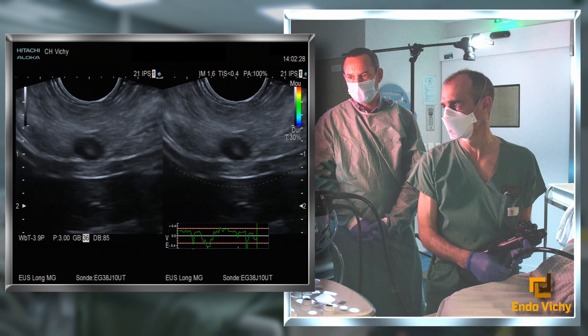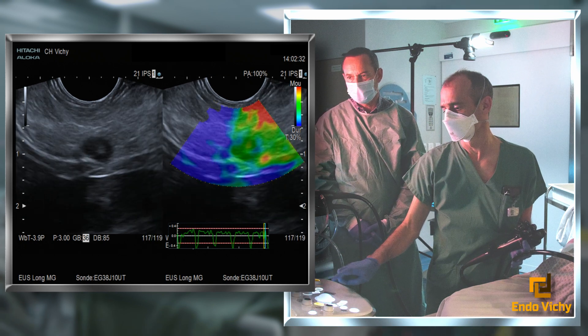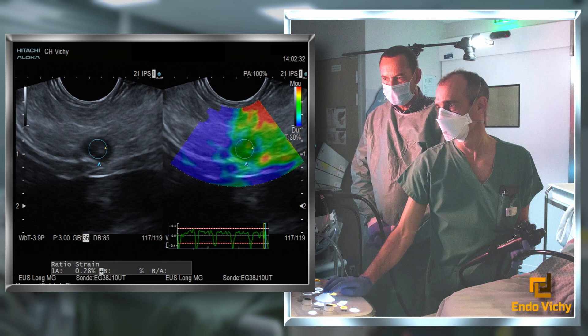The elastographic analysis is not typical of a NET in this case, with a non-indurated tumor. The procedure is performed under deep sedation, with antibiotic prophylaxis and systematic administration of NSAIDs.